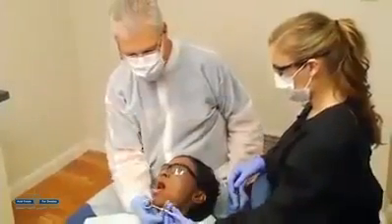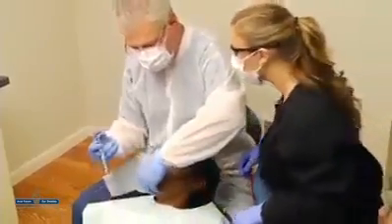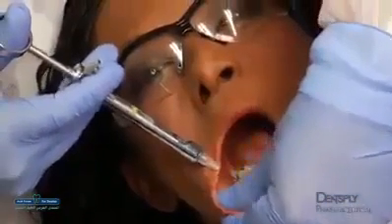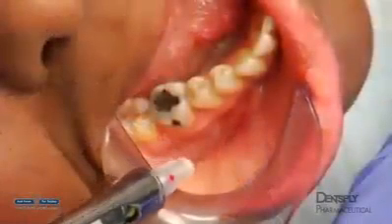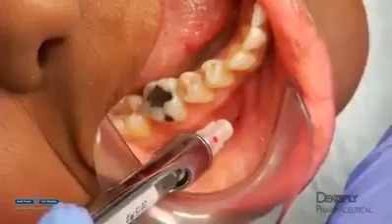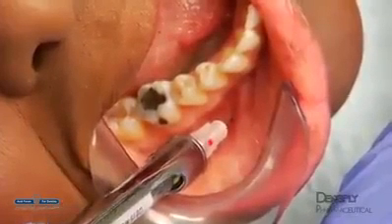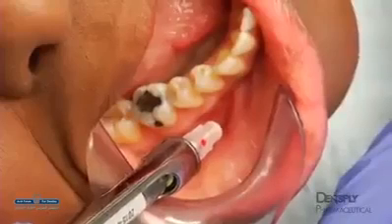This injection is best accomplished with the clinician positioned behind the patient. The lip is retracted between the thumb and forefinger, and the foramen is located. With the tissue pulled taut, penetrate the buccal vestibule adjacent to the second premolar, advance the needle 5 to 6 millimeters, aspirate, and slowly deposit about 1/3 of the dental cartridge.